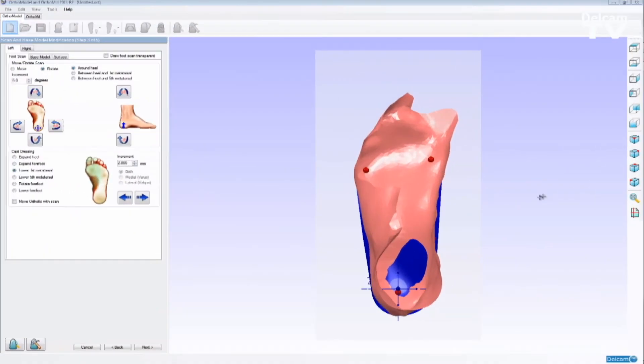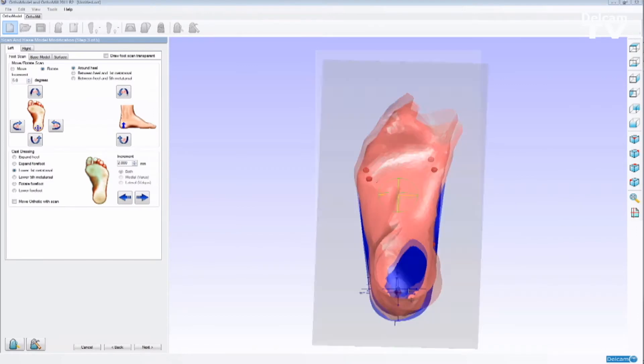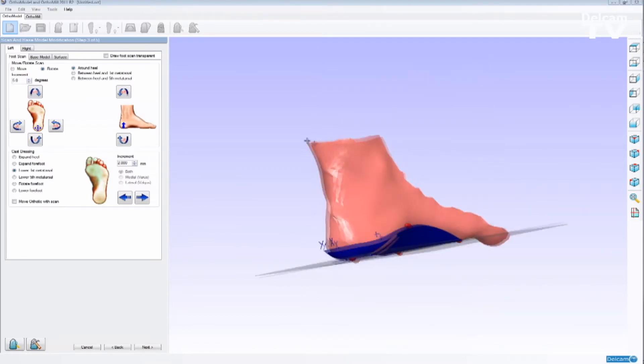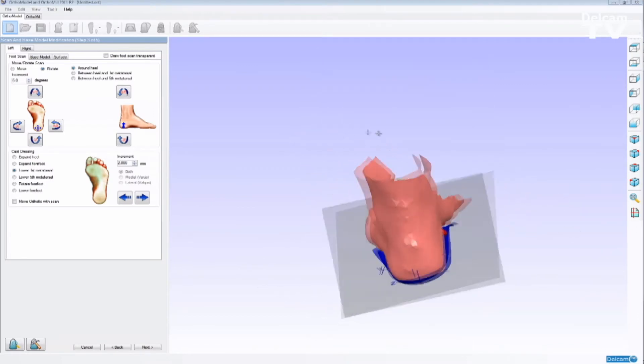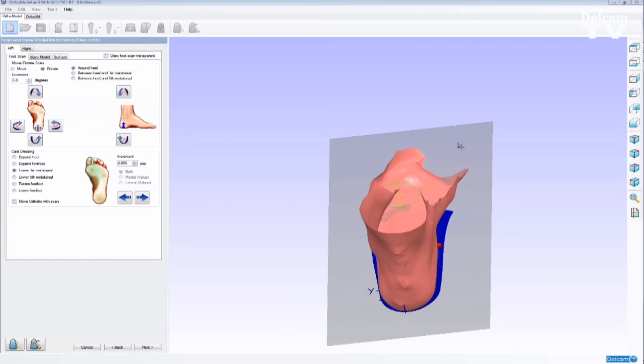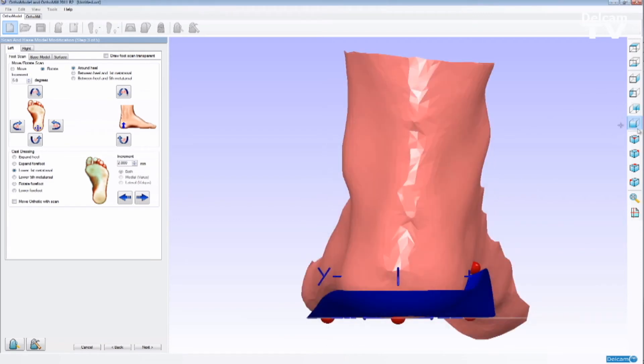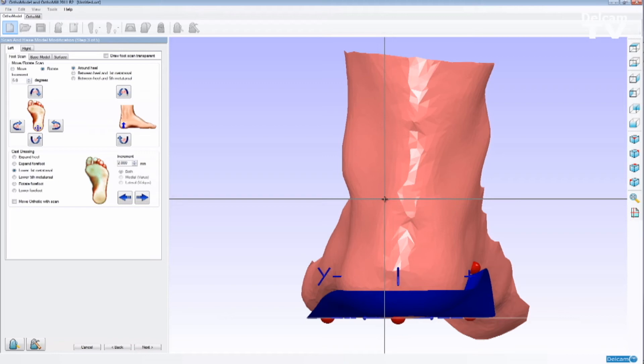Now that we have the foot scan on the screen, we're able to apply cast dressing operations and also design the orthotic based on the patient's foot shape. By turning on the crosshair cursor, I can analyze how the calcaneal angle is aligned.